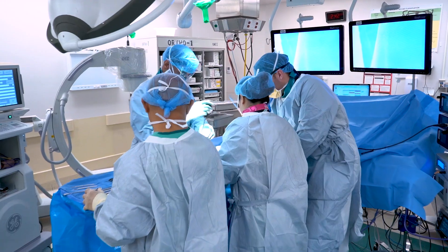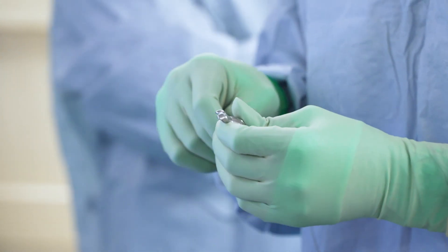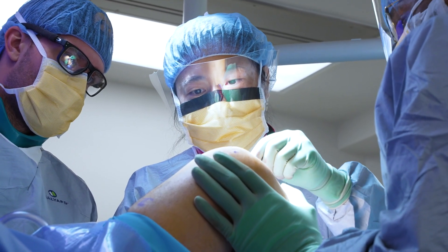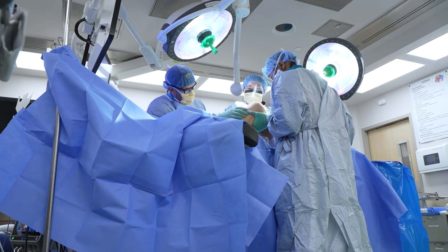Dr. Lee was among the first surgeons in the country to perform the Misha procedure. It's not really that invasive. Yes, it is still a surgery, but we're not actually going inside the knee joint — we're going on top of the knee joint. Right by the MCL, the medial collateral ligament, we put this implant into place.